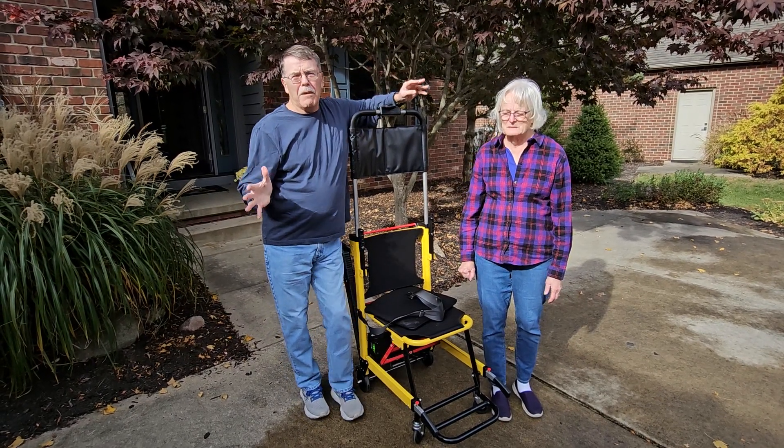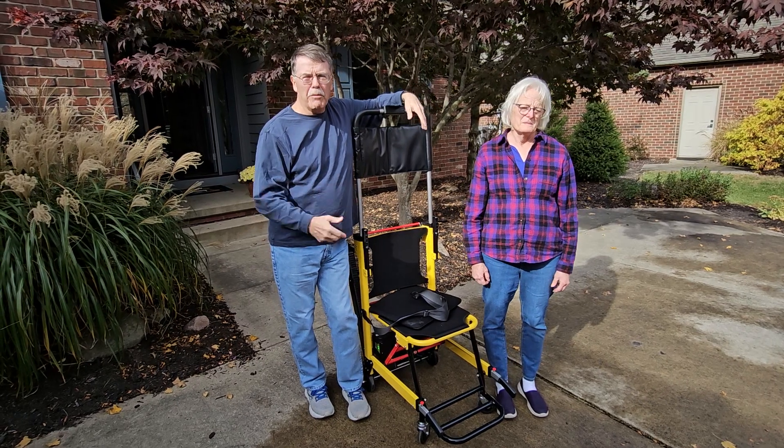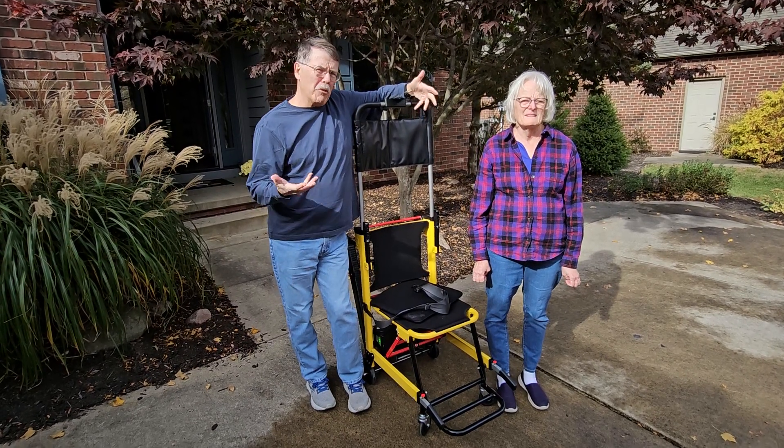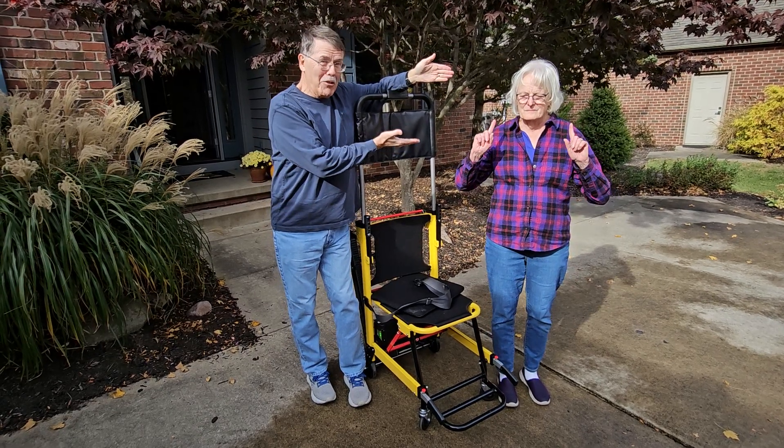Sue, we found something to try to make it easier for you to get in and out of our house, and I just want to give a brief demonstration because it's far easier to show a picture of this than to try to describe it. For these purposes, Gretchen is going to be you.